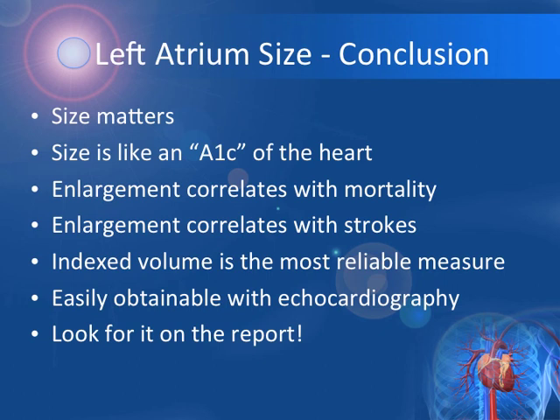It is very easily obtainable with a transthoracic echocardiogram, and a transesophageal echocardiogram is probably the gold standard for assessment of the function of the left atrium, as well as the assessment of clots and the left atrial appendage. Now, please do look for it on the echo reports.